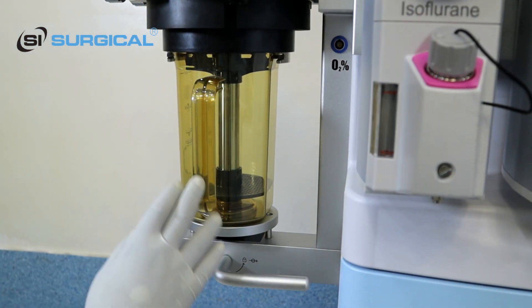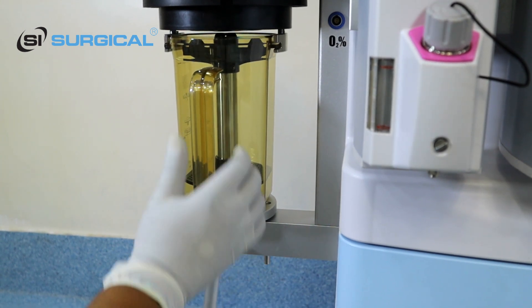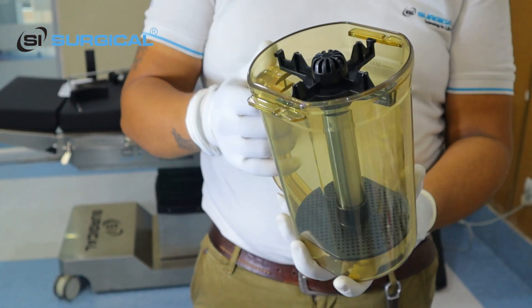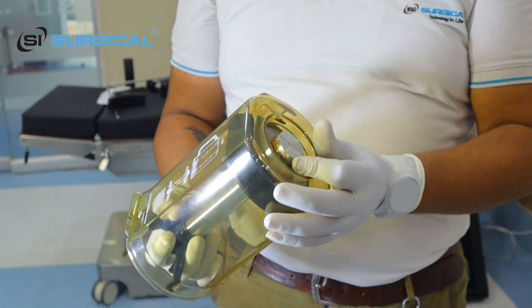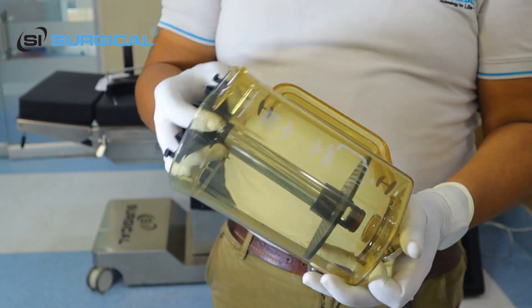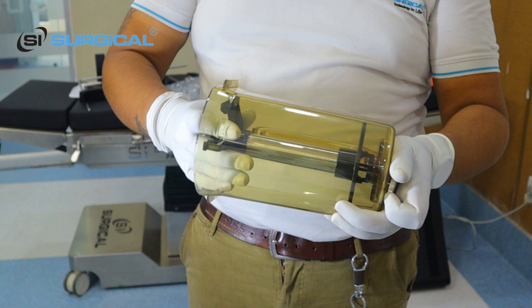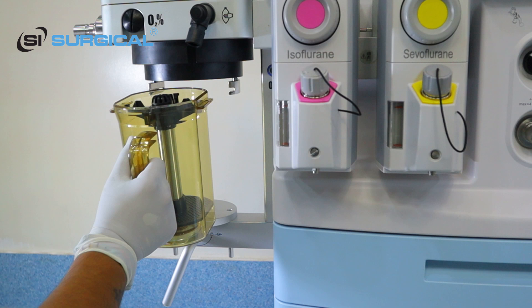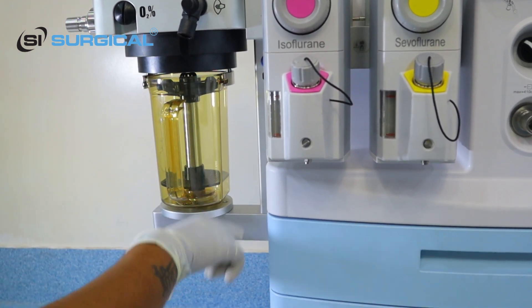This is the soda lime jar. It will be locked — if you want to open it, rotate it downward and pull it up. We will fill the soda lime here. If you want to clean the inside part, you just rotate this rotator and open it — it comes out. If you want to connect it again, place it here and lock it properly, then rotate it upward.